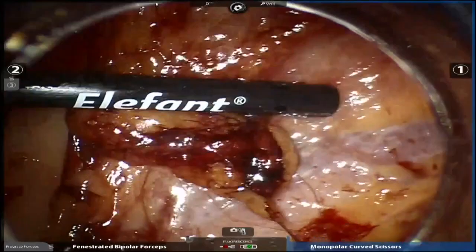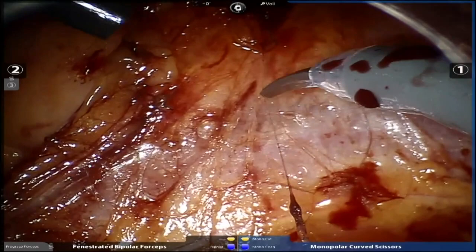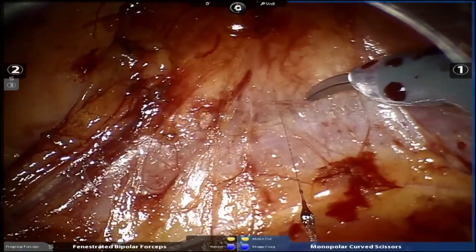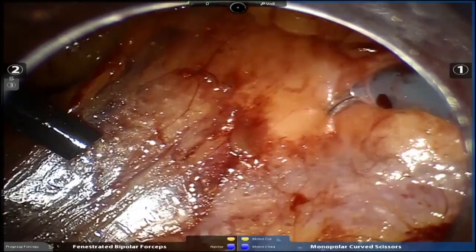Now, something I didn't show you when I came in is that my scope is oriented like this. The first thing I did when I came in is rotate the scope about 90 degrees. The purpose of that is to get the psoas muscle across transversely, okay? And that gives me orientation. It's a very important point. So the psoas is always your first landmark. Yes, the psoas is my first landmark, and I want to rotate so that it actually is across the screen.